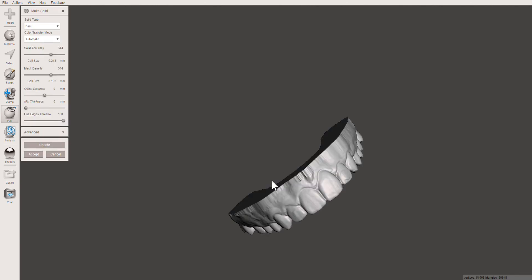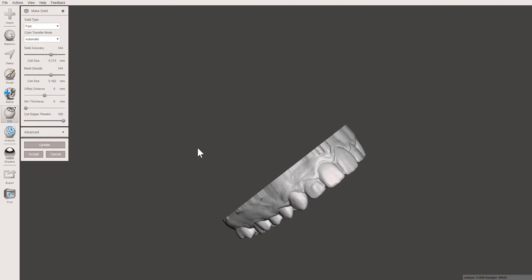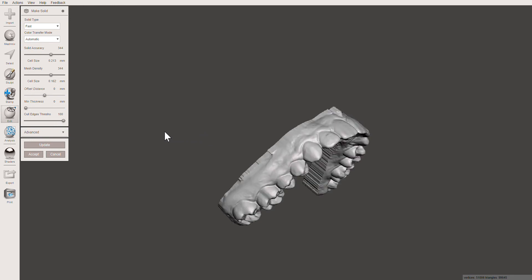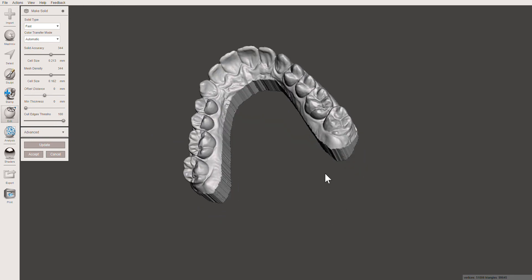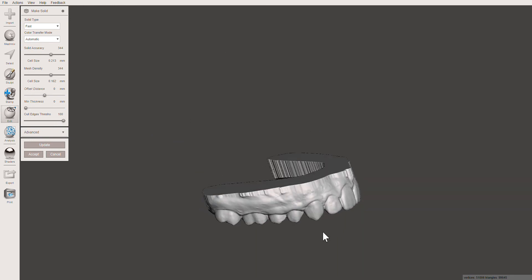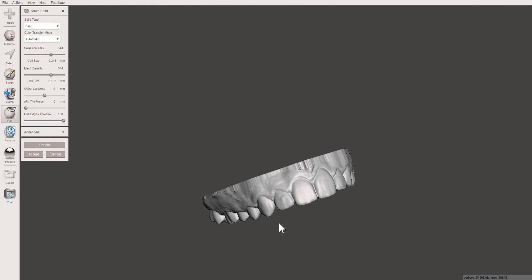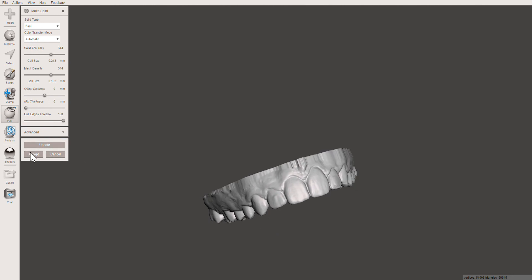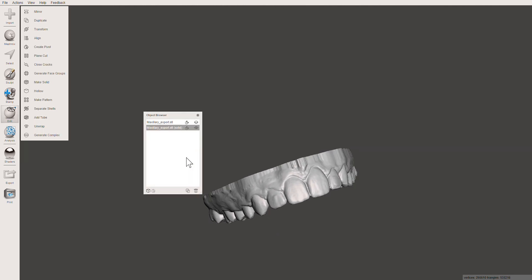That looks great. This is how you edit a model, and before you export it just make sure to press Accept — and you're done.